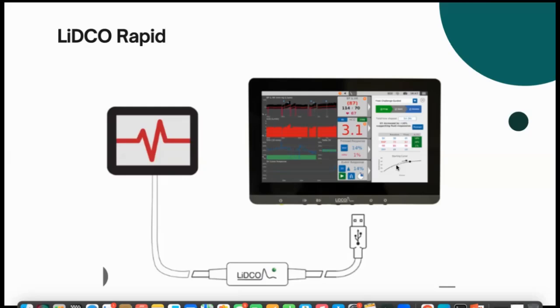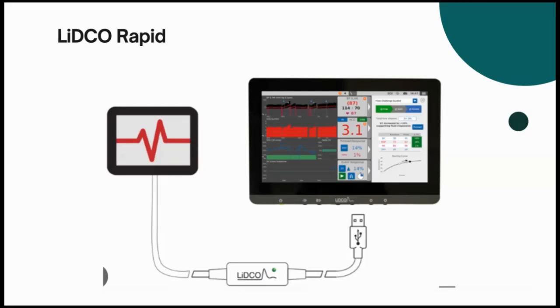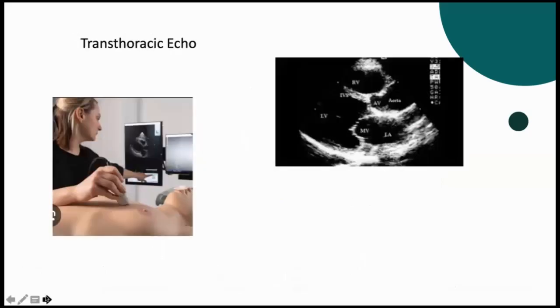So the next important thing that we can do is, we cannot say we don't have it, because we always have the ultrasound. Even during a surgery, if you have access to the heart, you can use the echo probe, slowly onto the mid-axillary line of the left side, and have a look. If you are in doubt, let's say a pelvic surgery is going on, and all of a sudden you suspect a pulmonary embolism, you should be able to take the short axis view here, and then if you rotate it, you can get the right ventricular outflow tract, the main pulmonary trunk, and the right and left.